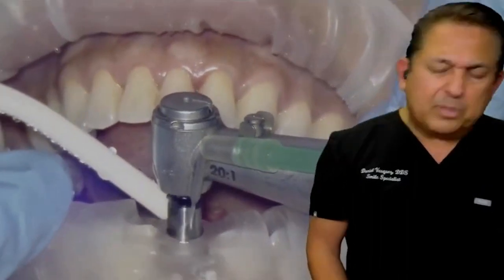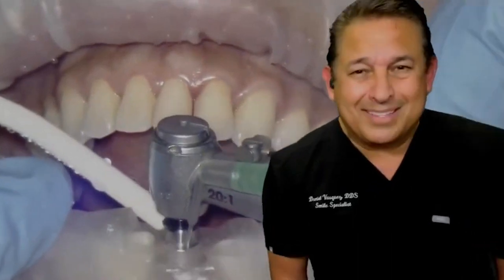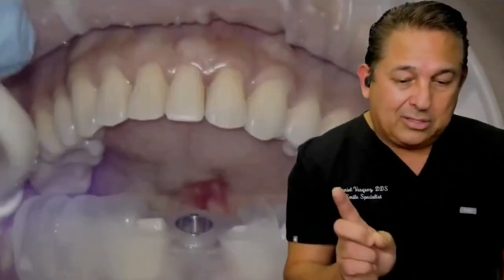And one of the beautiful things that I like about doing implants with surgical guides is you can't miss. And I'm going to show you that you can't miss. I'm going to just bring one more drill before I move forward.